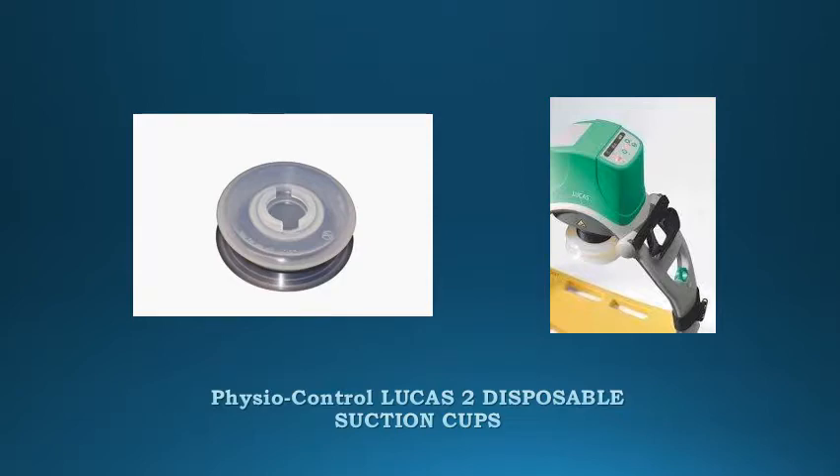Fisher Control Lucas II Disposable Suction Cups — 3-pack for the Lucas II Chest Compression System. Easily changed after each use.